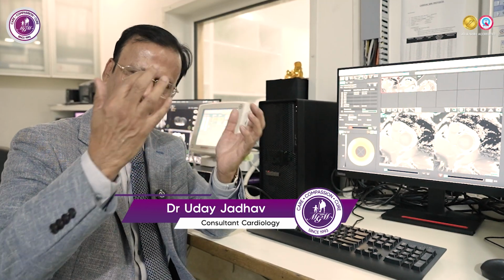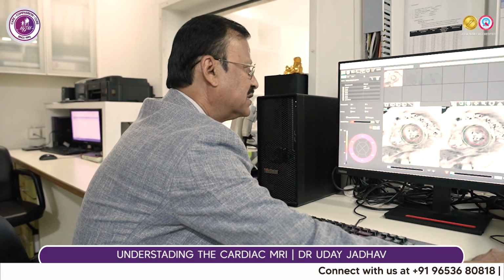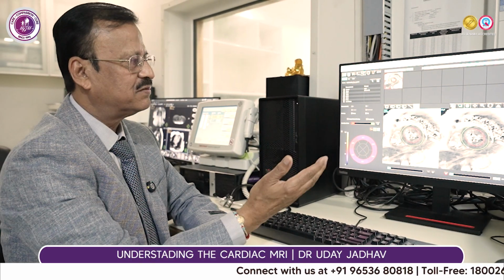Has it thickened? Is it showing a swelling of the muscles? That's called myocardial edema. Is it damaged? Are there scars in the muscles? So various aspects of all these parameters are looked at, and this, for example, sequence helps us to understand whether there is a swelling of any portion of the muscles of the heart.